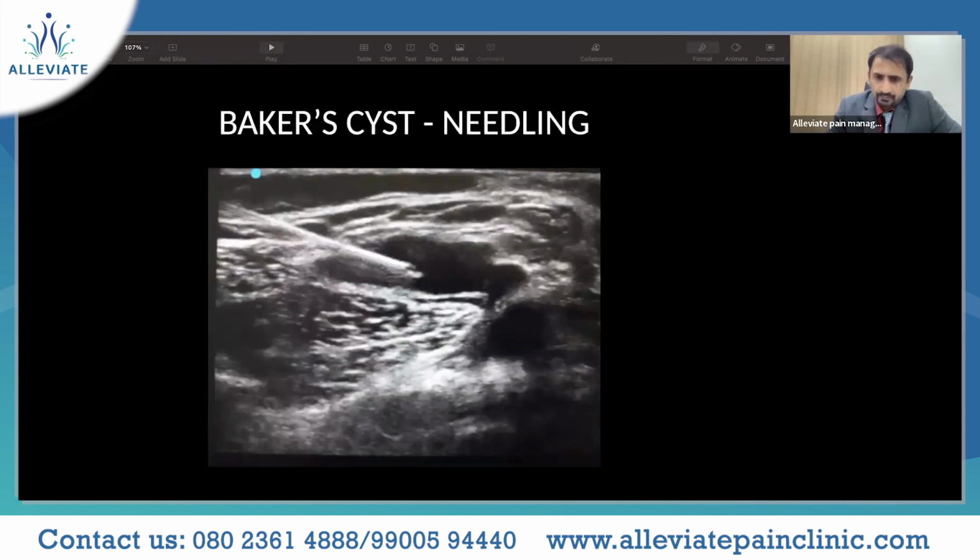This is again an aspiration or needling technique where your needle is in the bursa. And this is an echogenic needle, whose texture can be appreciated very nicely under ultrasound. If it's available, this could always be considered. All your Stimuplex needles are echogenic needles as well.